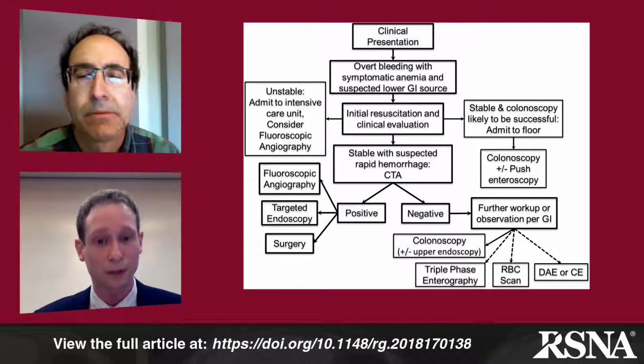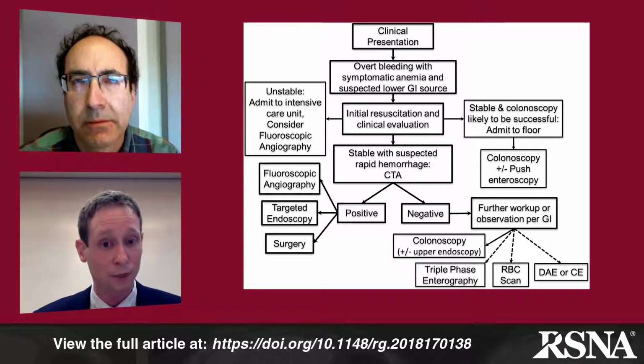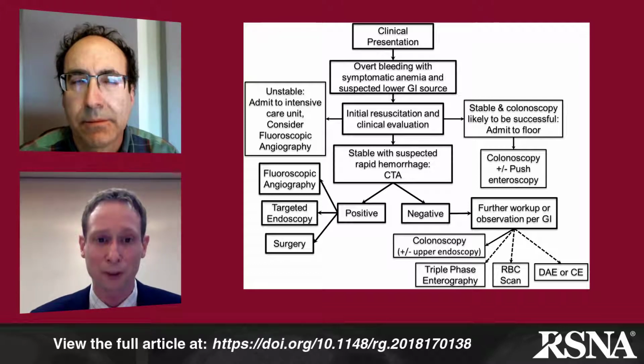Sure. The limitations of fluoroscopic angiography are it's invasive, and it needs a vascular route to get to the source of bleeding. So patients who have bad atherosclerotic disease or maybe variant anatomy could represent an impediment to evaluation with fluoroscopic angiography.